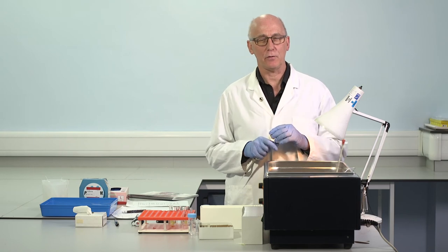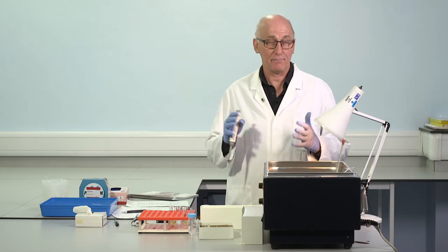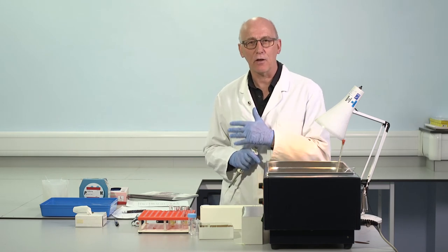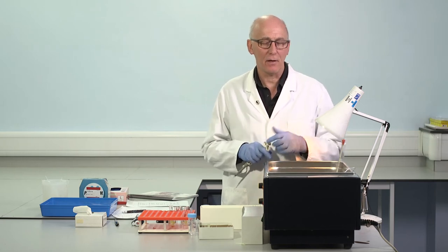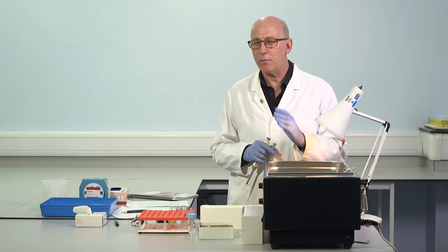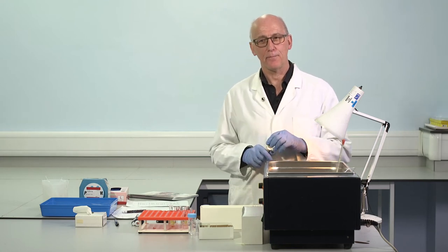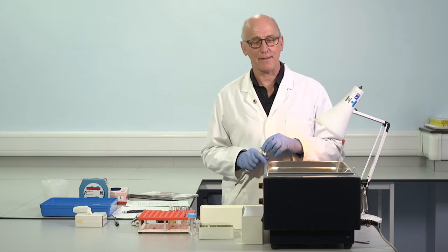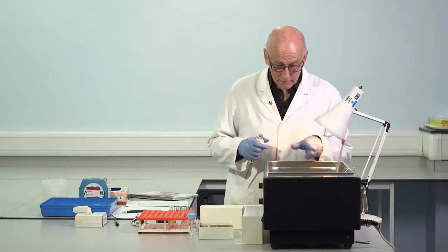This will not be a patient who completely lacks one of the clotting factors. If a patient completely lacked factor 8, severe hemophilia A, APTT will be much, much longer than this for this reagent. Typically, 90, 100, 110 seconds, maybe longer. This is only 47, 48. So that already tells us we're almost certainly not looking at a really, really severe deficiency. If it's deficiency, it will be something with a milder abnormality. So it will contain some concentration.